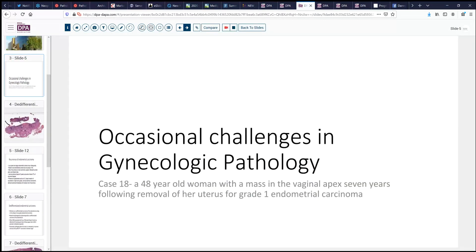We're going to continue our theme of gynecologic pathology today, looking at one of the fairly complex cases that occasionally comes through the door of our cancer center. This is a fairly young woman, 48 years old, who has a mass in the vaginal apex. This has occurred seven years following removal of her uterus for a grade one endometrial carcinoma, which was also apparently a low stage.